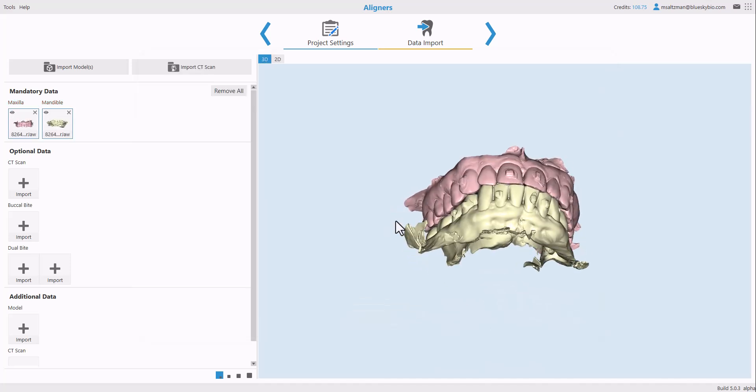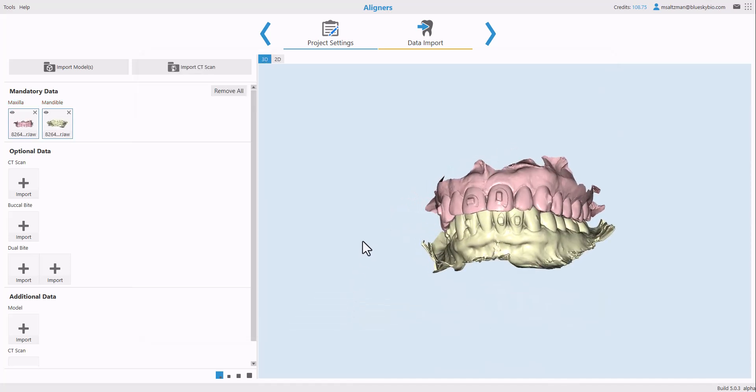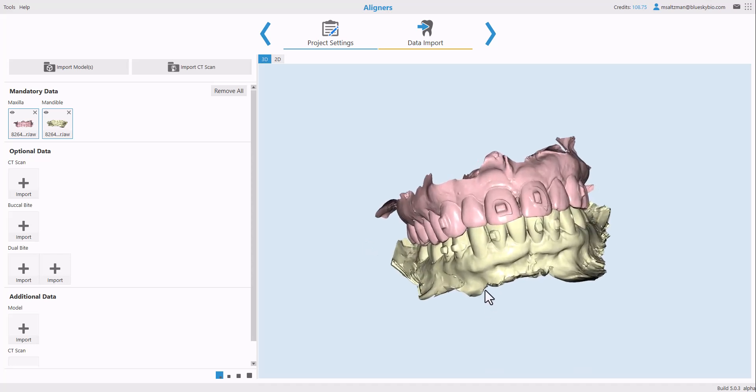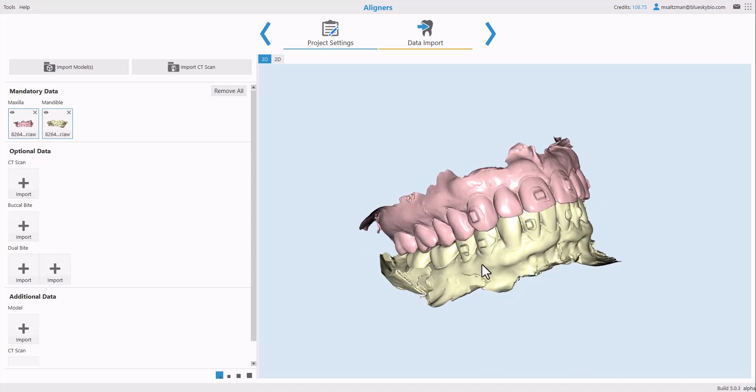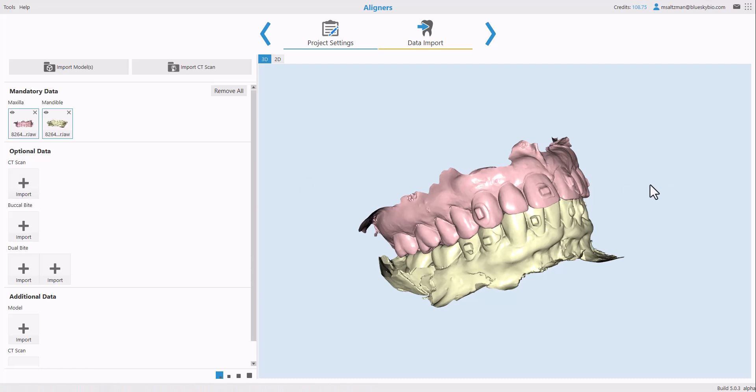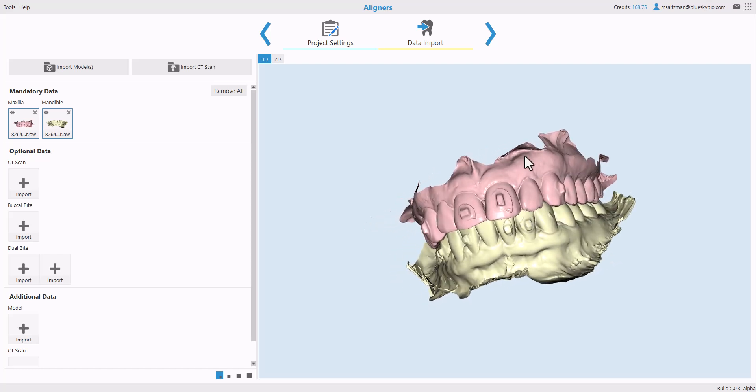We can now see that the models have been added to the scene. If a CT scan is available and it's highly recommended, go ahead and click on the plus here to select the CT scan as well. We are now going to click Next.